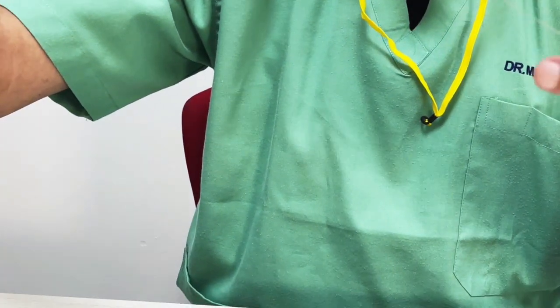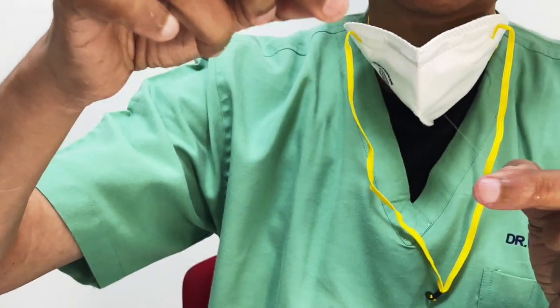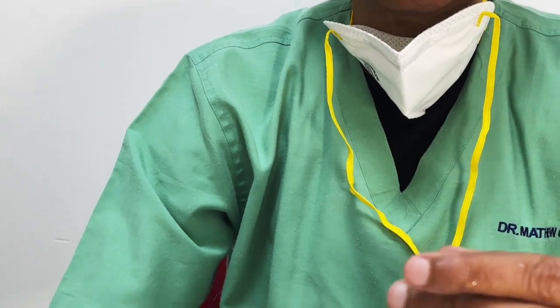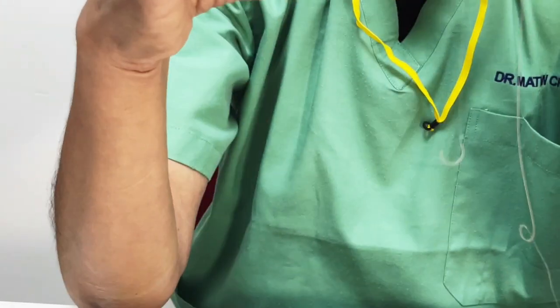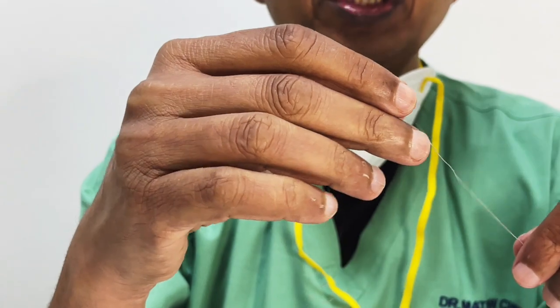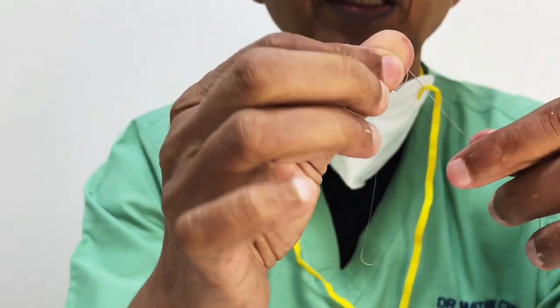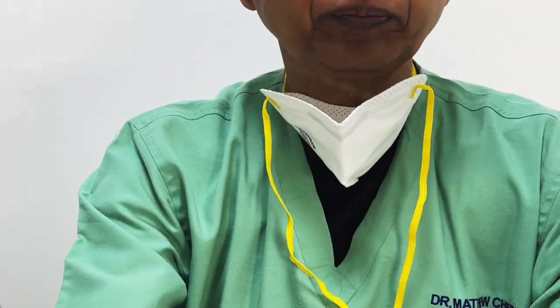So remember, stretching is a property that can happen if you pull and push a coil several times. But having said that, it is also ridiculous to keep stretching the coil till the tip of the coil is out of the groin. So much simpler, if you're in such a situation, pull your guiding catheter down, push it into the external carotid artery, and push this coil mesh like this. You push it through the mandrel, make it a knot, push it into the external carotid and detach it.